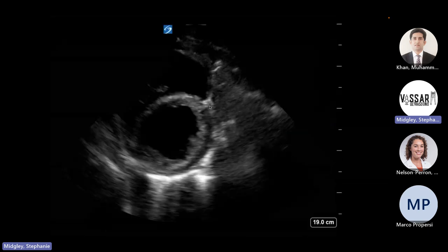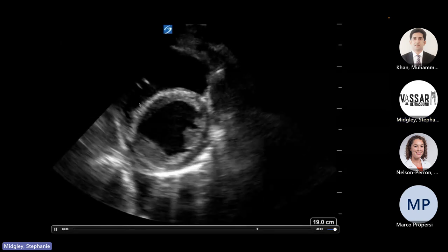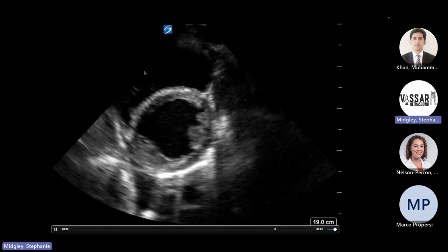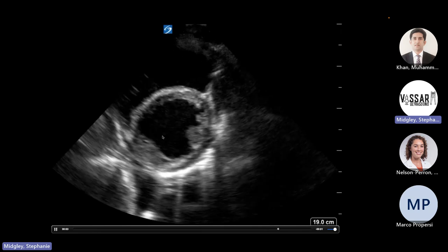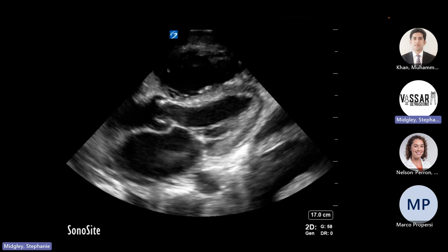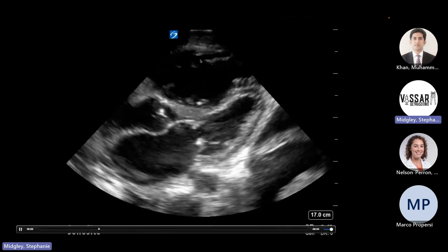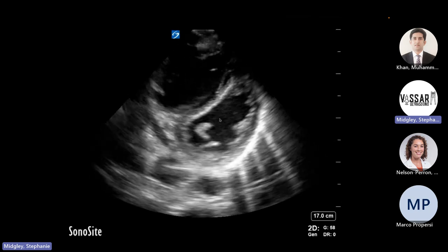And if you go back to the heart that wasn't working very well, even this one with the akinetic septum was still round and going into the right ventricle. So this is nice and normal. This tells me that the pressure on the left side is higher than the pressure in the right. Once the septum starts bowing into the left ventricle, the pressure on the right side of the heart is now higher than the left. And that's totally pathologic.